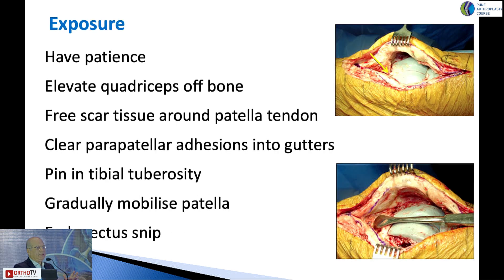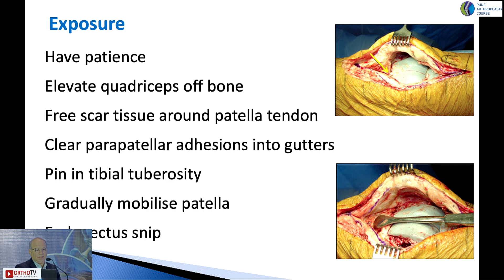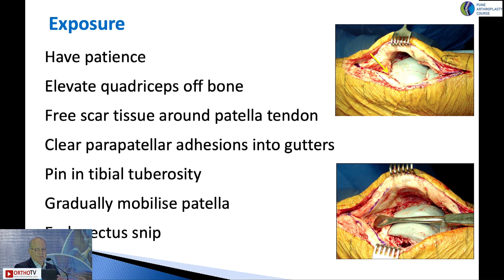When exposing these knees, you need to have patience. You can see how the quadriceps is stuck to the femur. First, with the cautery, release the quadriceps. Take a cobs or periosteum and run it along the anterior femur all the way up the thigh, releasing it. Then come down towards the patella tendon and anterior tibia, excise all the scar tissue, freeing the patella tendon. Move into the gutters and clear them out. At that stage you're ready to start mobilizing the patella, but before you do that, put a pin into the tibial tuberosity because there is a risk of avulsing it. Then try to subluxate — not evert — the patella, and at this stage do a rectus snip.